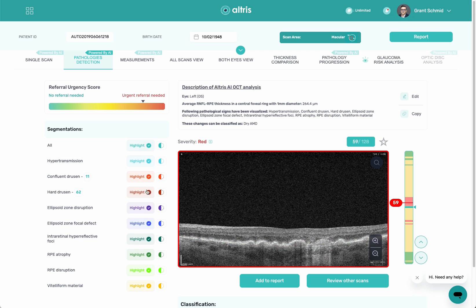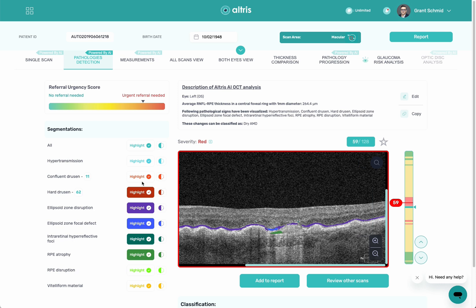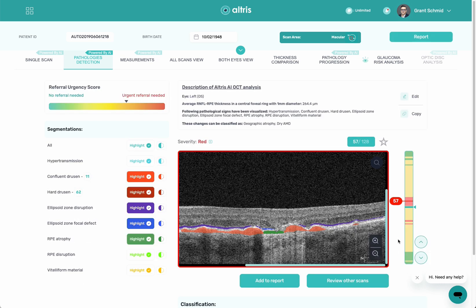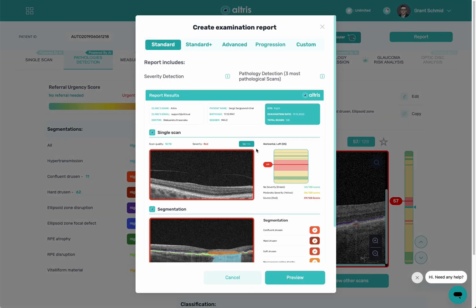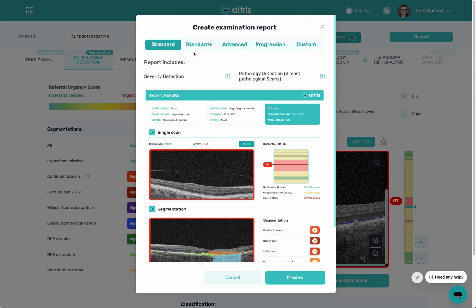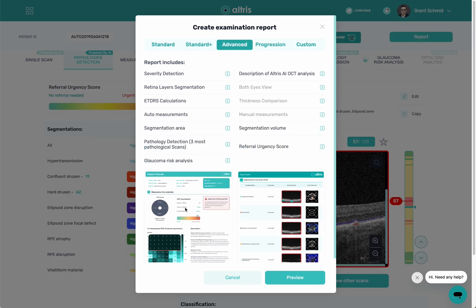I can turn these identifications on or off, zoom in, and use it for patient education. I can scroll through the OCT and see how things change. I also have a report system — I can click on this report button and generate a lot of different reports. This is our standard report, and we have our standard plus report which shows more information, and our advanced report with even more information.